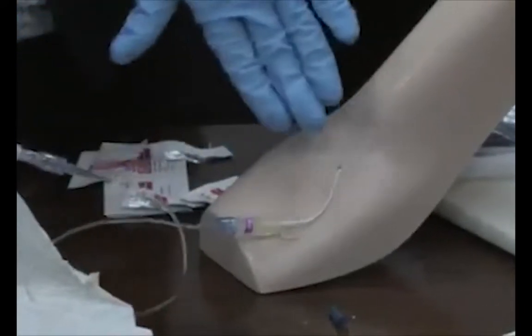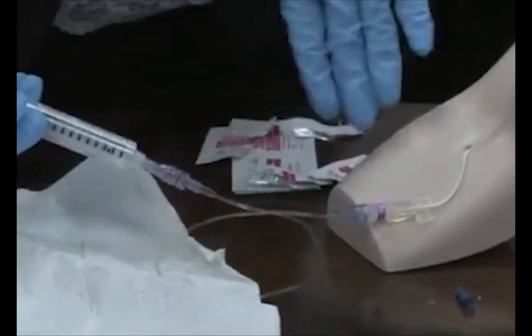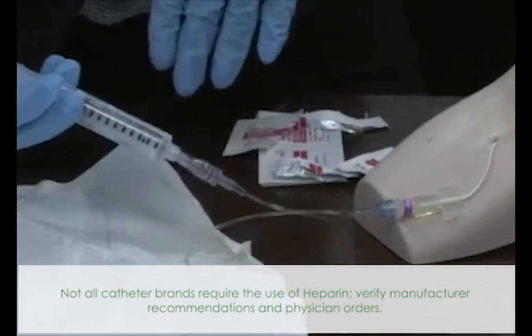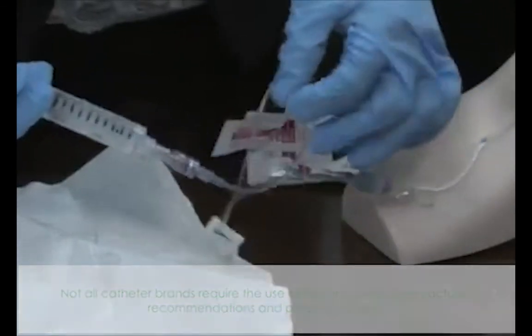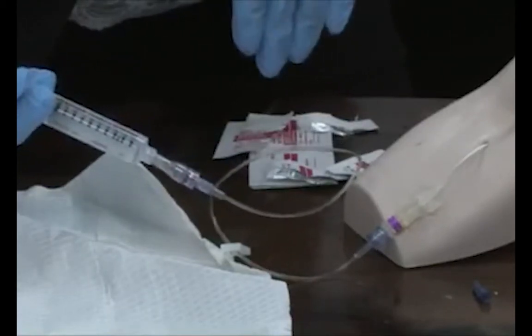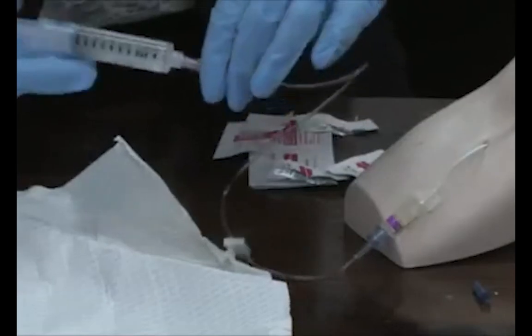Whenever you're flushing the catheters to infuse something, you would use the sash method, of course, saline. Administer your medication, saline and then heparin. On the open-end catheter types, you would use heparin at the end after flushing with the saline.